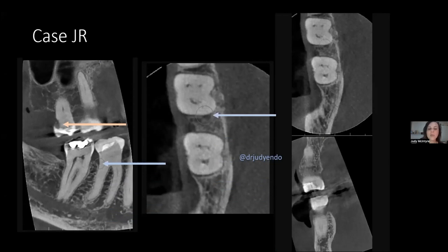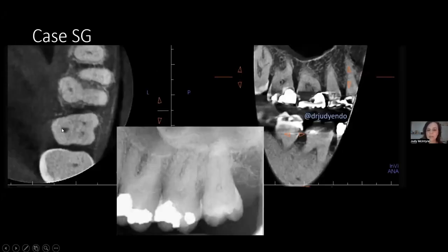And patients are really receptive when they see this. This patient just came back because she appreciated what I had found on this tooth as well. And the dentist had no idea that this even existed there with this amount of destruction. So this patient came and wanted to save their tooth.